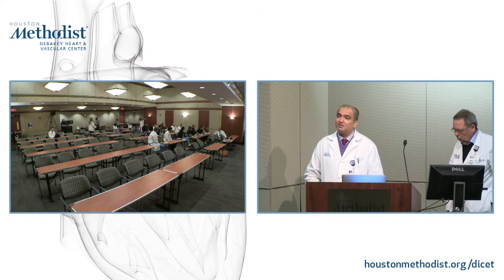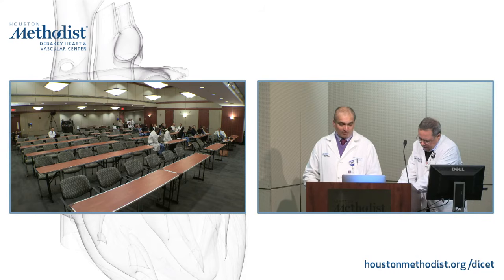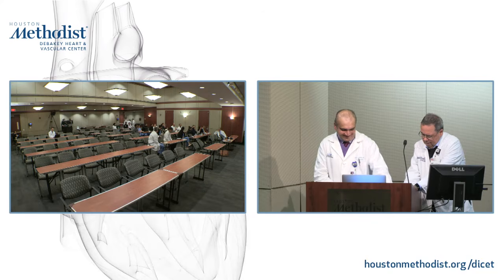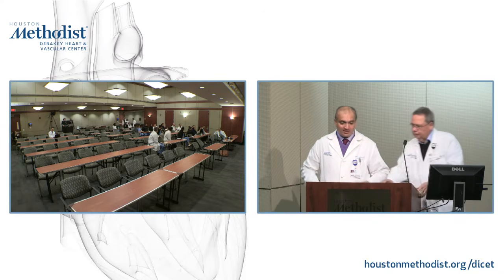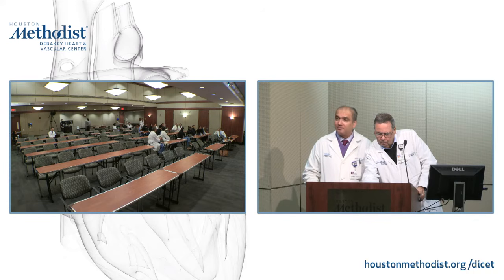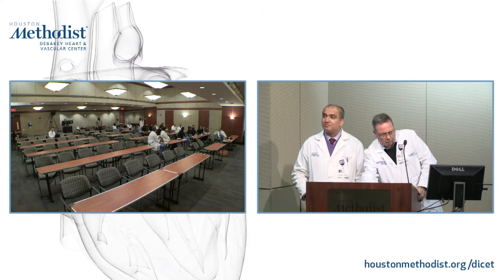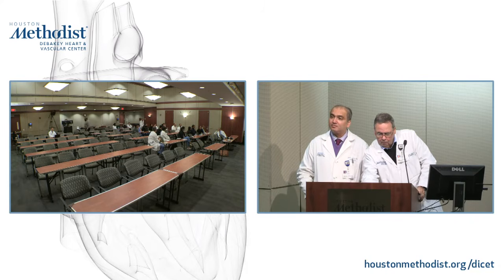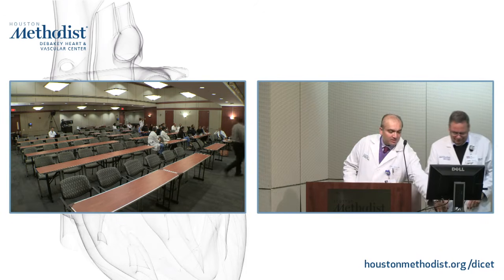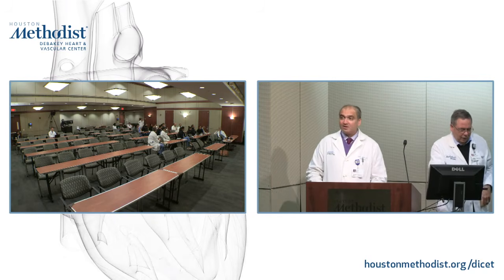But most often, if you're not doing the T2-weighted edema imaging, which, as all of us who do MRI know, is difficult sometimes to do or interpret, it may not give you information about disease activity. So if you're looking at disease activity, even in early cases, then FDG PET might help in these patients. And many of these patients will eventually have ICDs, and not every center is scanning patients with devices. So if you want to follow disease activity after you implant a device, this is where PET has a lot of application.